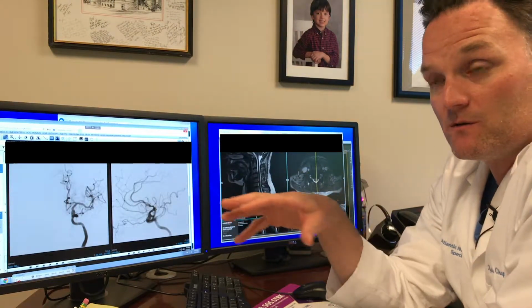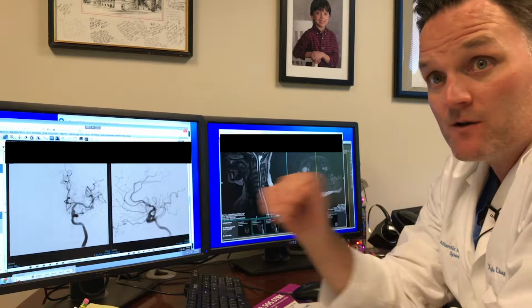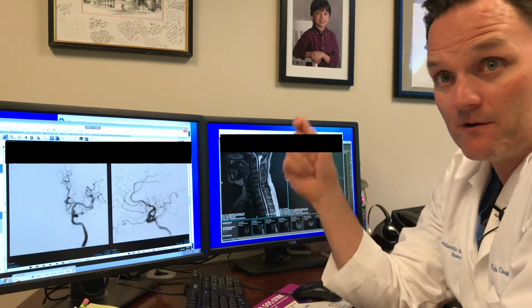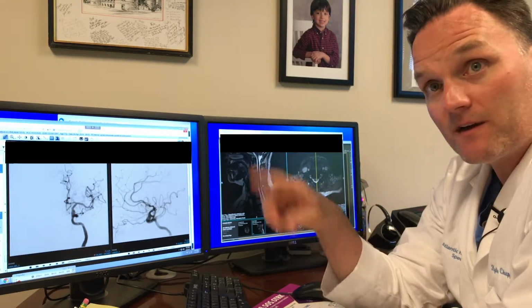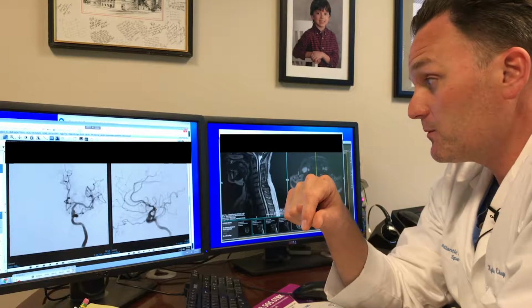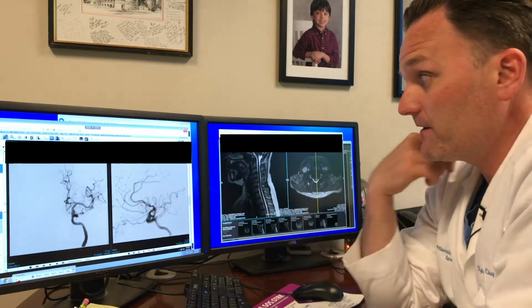And that's something that we do often. It's an emergency. Time is brain. So when patients have this anywhere in the state, they can go to one of the centers that we cover and they either get flown in or ambulanced in, but it's an emergency. We go there right when they get there. We go up with the catheters and try to retrieve things. We've had a lot of really, really good results. So that's one of the emergent things we do using the endovascular angiography technique.